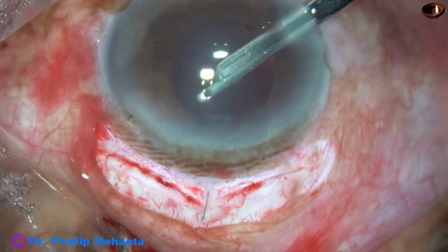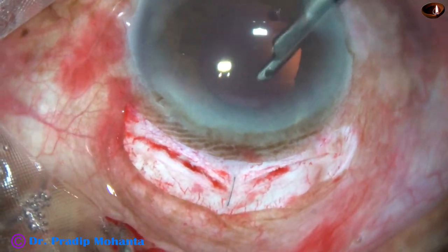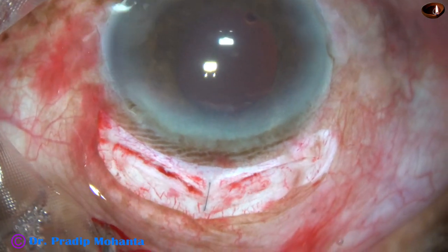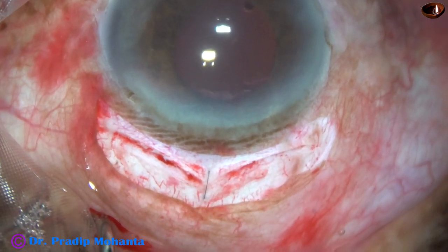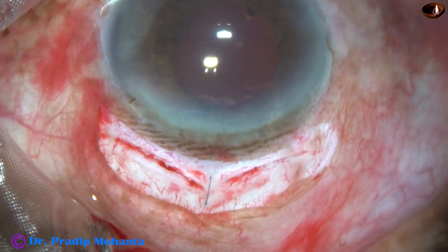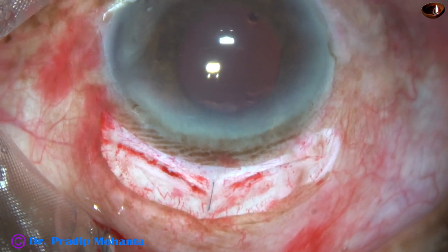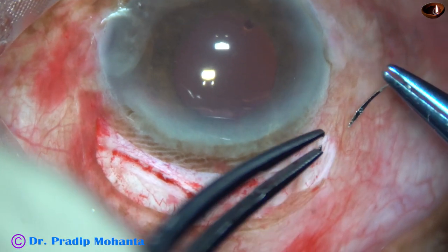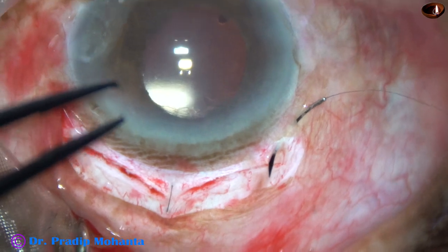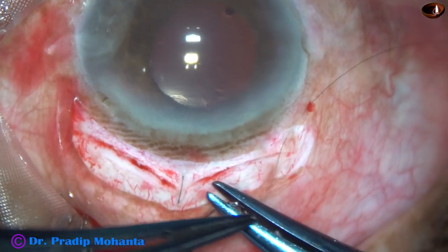When we do surgery in this way the cornea remains very clear the next day, and the patient can be refracted after 10 to 14 days. We can prescribe glasses to the patient and ask the patient to take a full head bath after a couple of days.